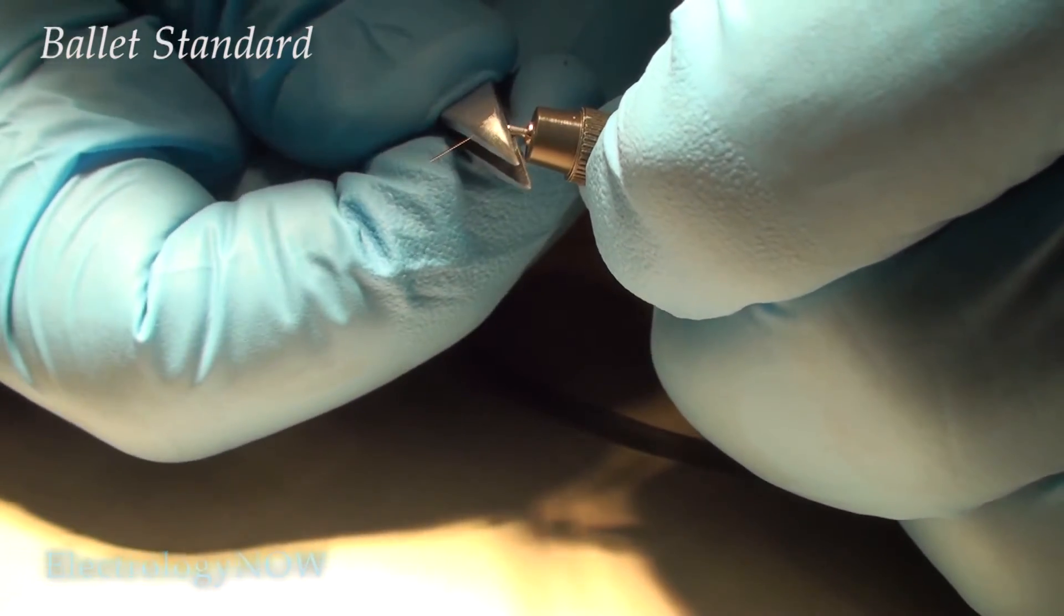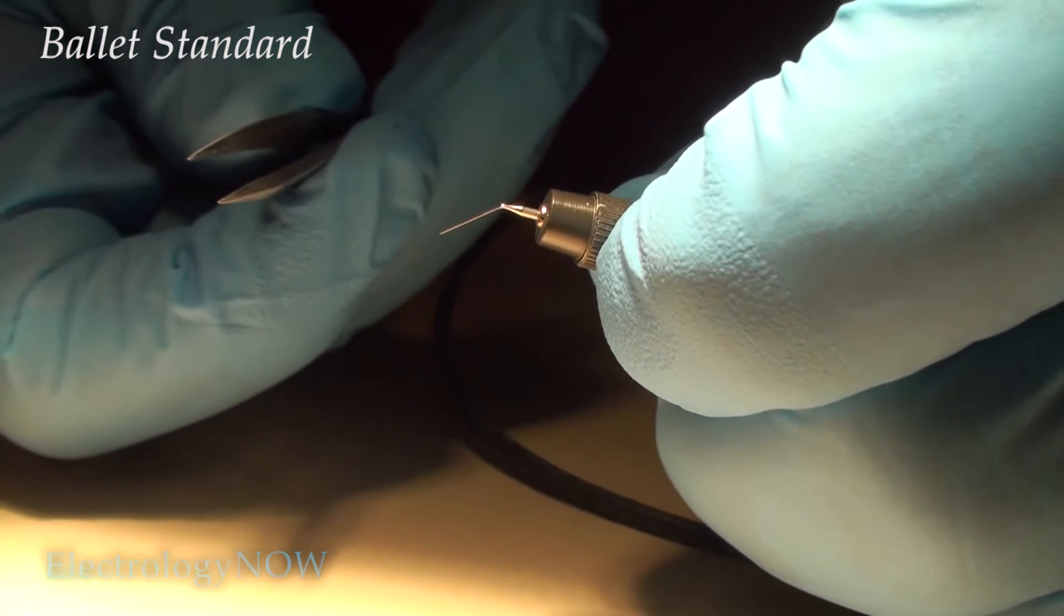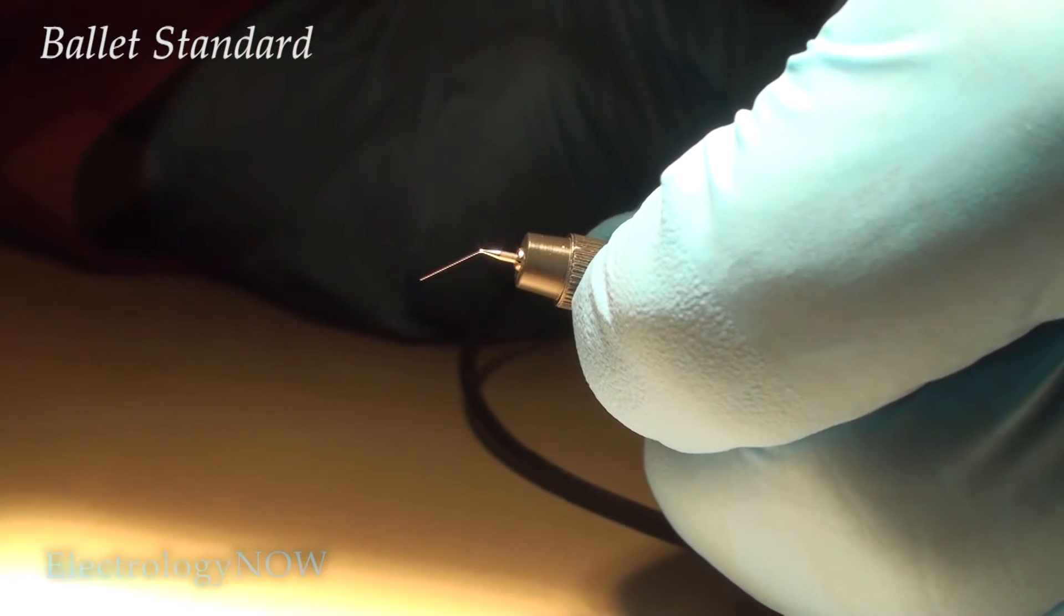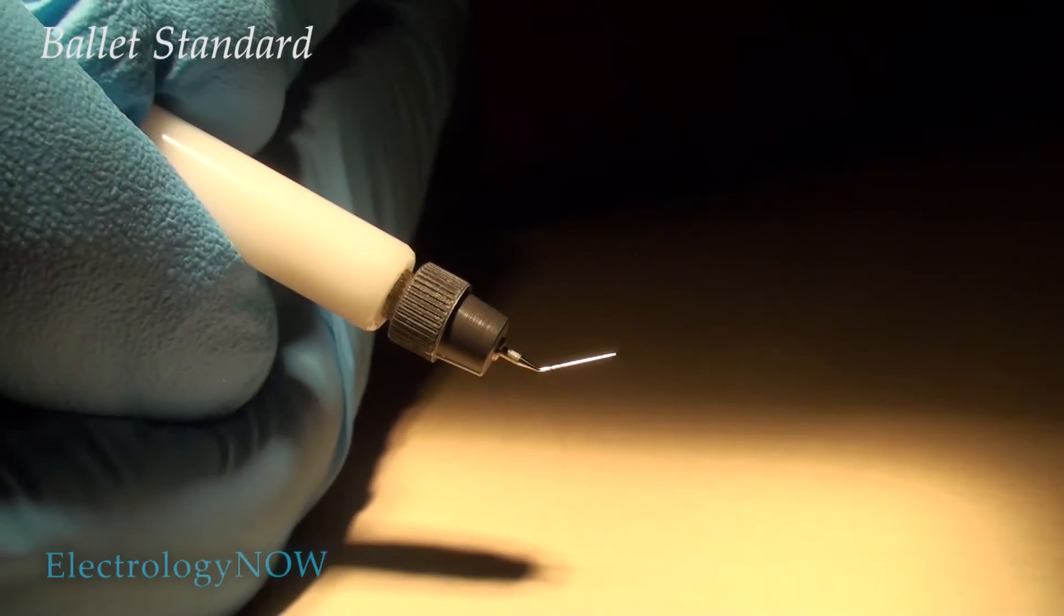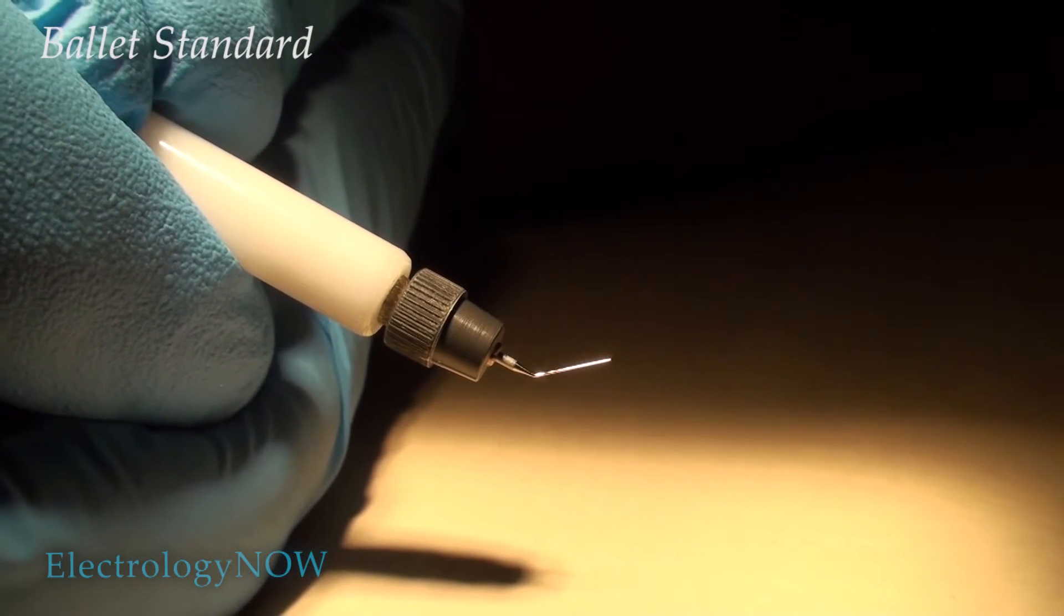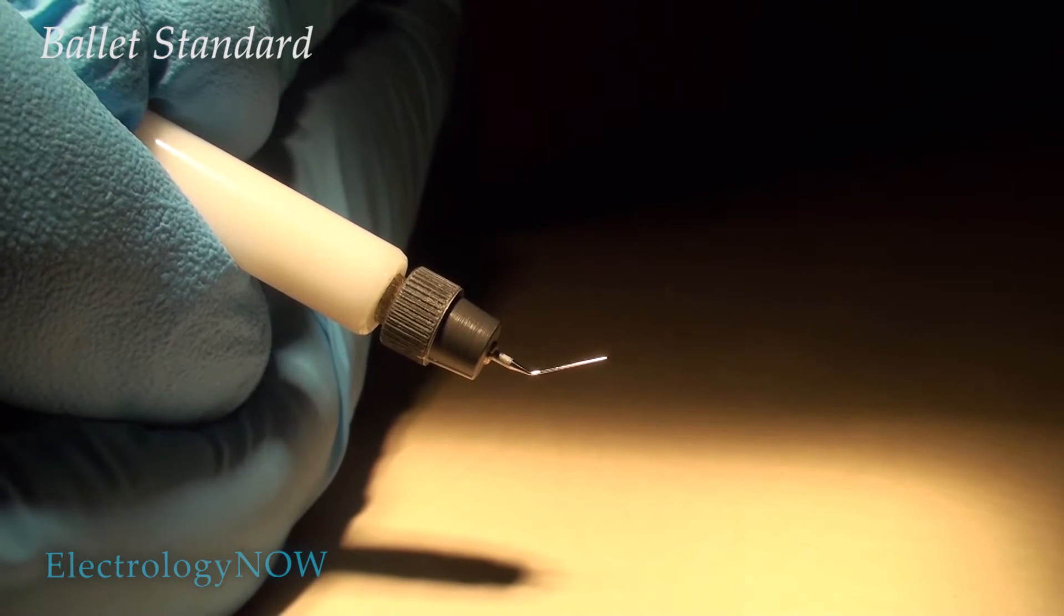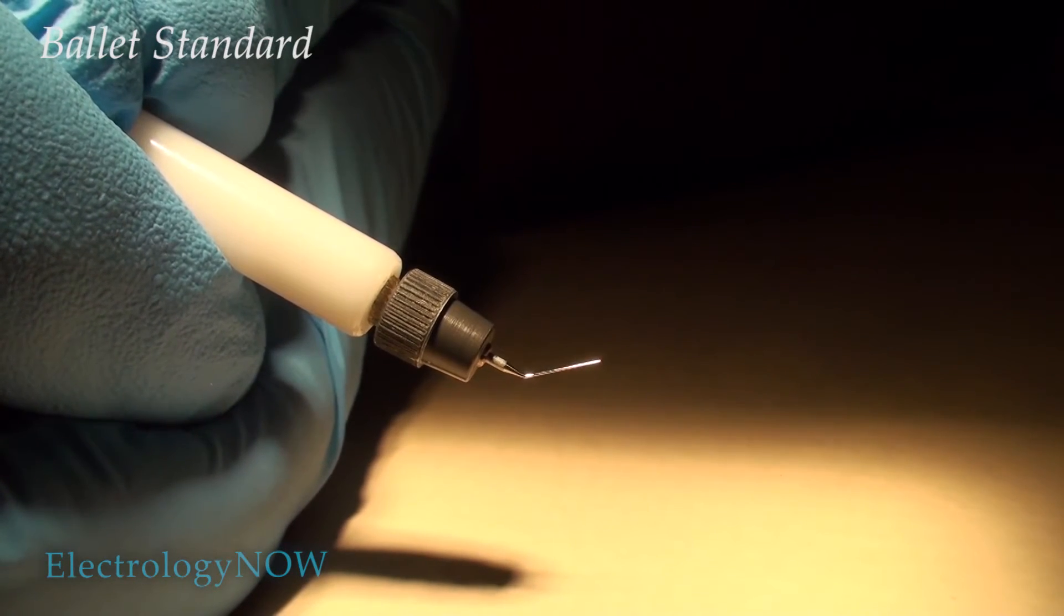This does shorten the working end of the needle, but for the most part, unless you're working on really big hairs, this will be fine. Here's your standard K-5 Ballet needle that's been bent, and you'll be using it in this position most of the time.